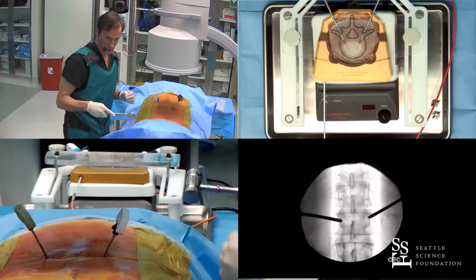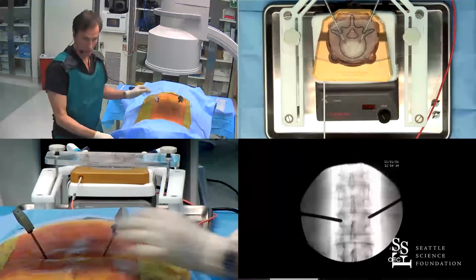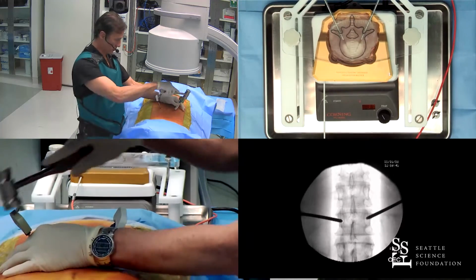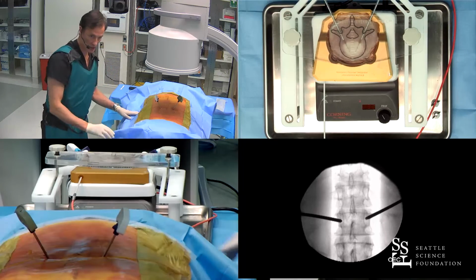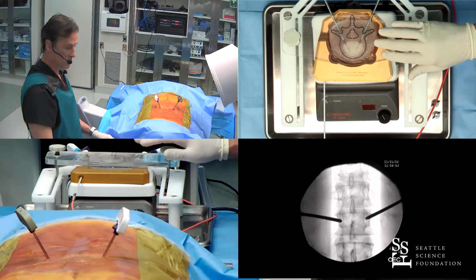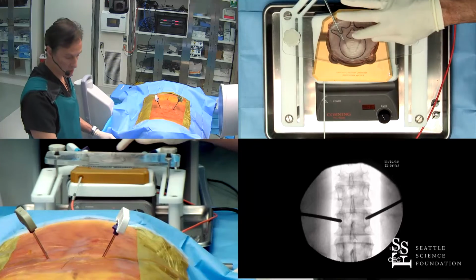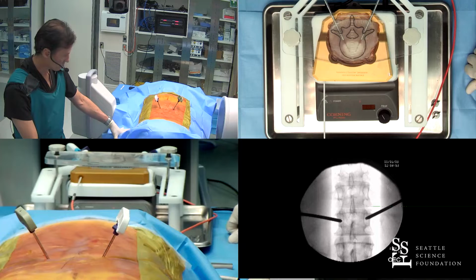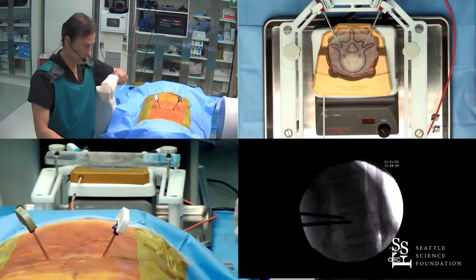All right. And again, we will make sure to mind our landmarks, not to cross the medial border of the pedicle until we're in the posterior portion of the vertebral body. Let's check that laterally. We always do the ablation first, and we've done the ablation with the chicken model, and you can see it encompasses the vast majority of that vertebral body. But once we access, we're in good position here.